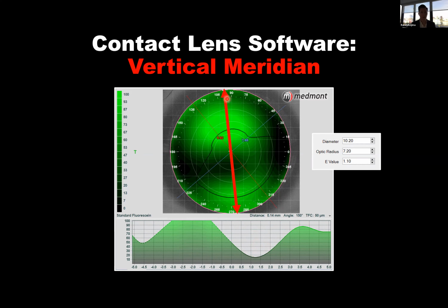So for this eye, the cornea is high, the cornea is low, the cornea is really high, the cornea is low. This is a very challenging eye surface to fit with corneal GPs. With 600 microns of height differential, this is a patient that really is a challenge for the corneal GP.